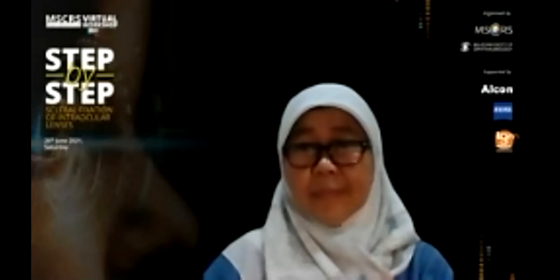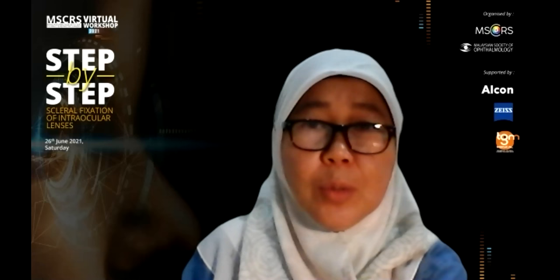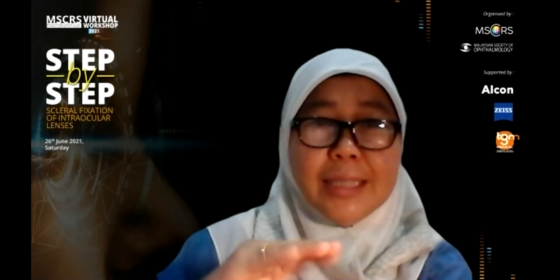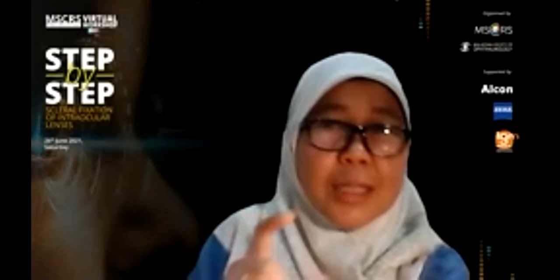Will the length of the intrascleral tunnel play a role in that scenario? What I mean is that if the tunnel is short, then the haptic is like a dangling thing, and the lens might just rotate at that axis. Is there a possibility? I'm just talking about the tunnel.